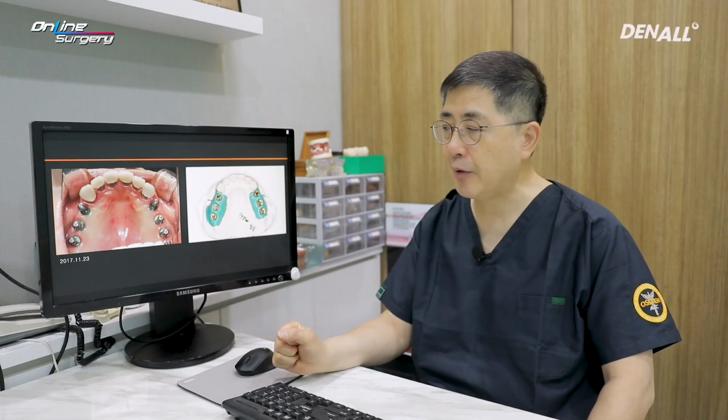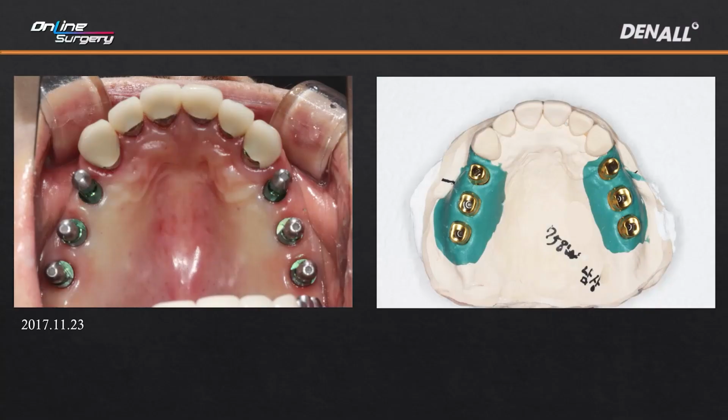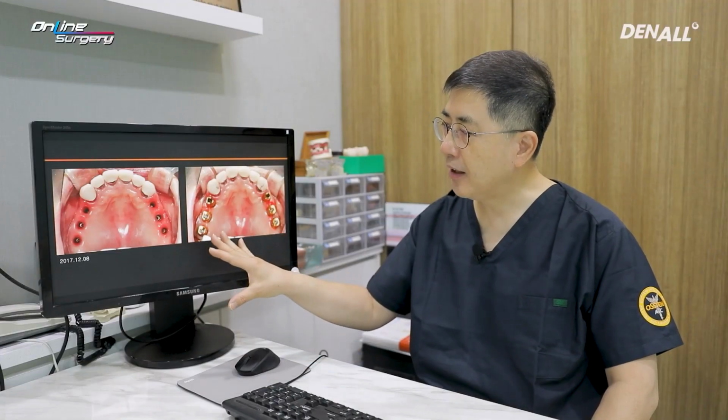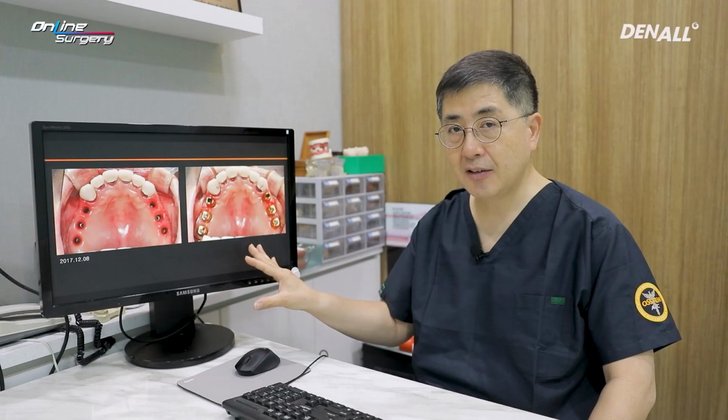Let's take a look at the final restoration process. After 2 months, transfer impression copings were used to make model. And I always use CAD/CAM abutment, 1-fit abutment all the time. I made 3 1-fit abutments. And after removing the provisional restoration, customized 1-fit abutments were delivered. Abutment level impression was taken, and ER-type zirconia prostheses were fabricated.